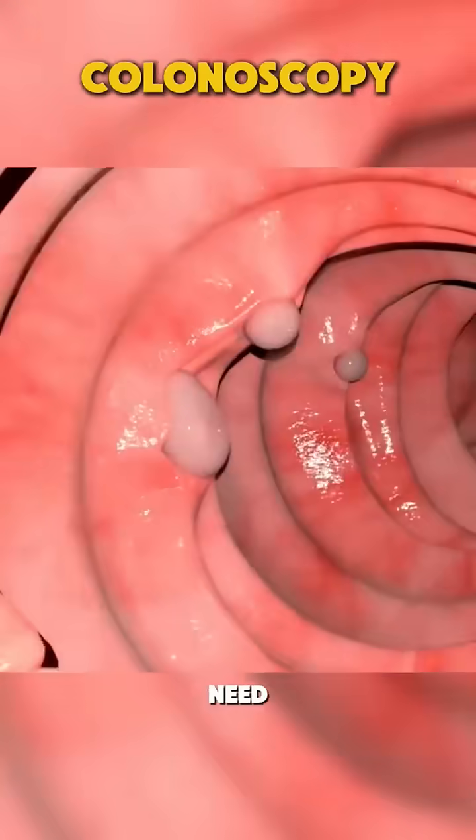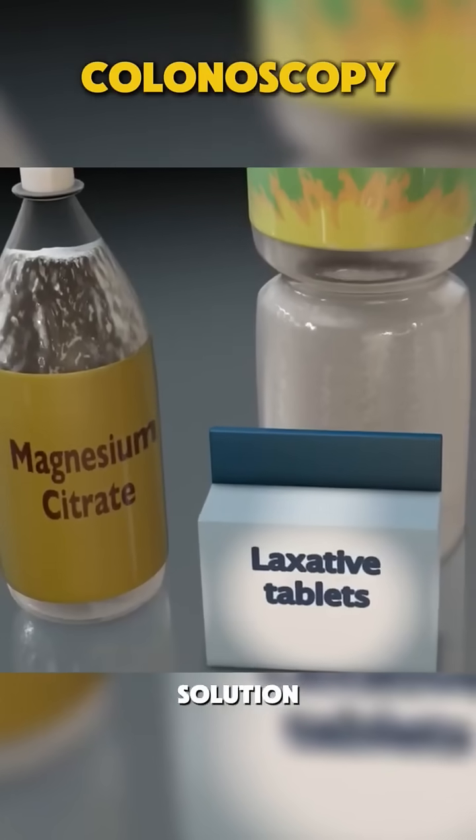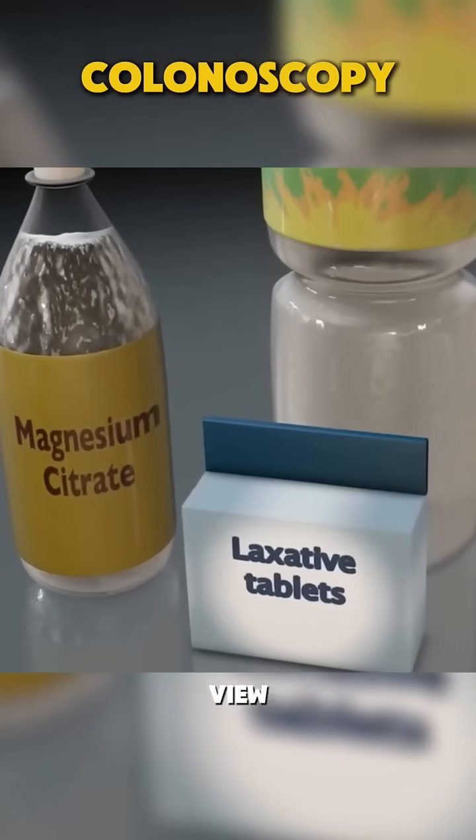Before the procedure, patients need to clean out their colon by following a special diet and taking a bowel cleansing solution. This ensures a clear view during the exam.